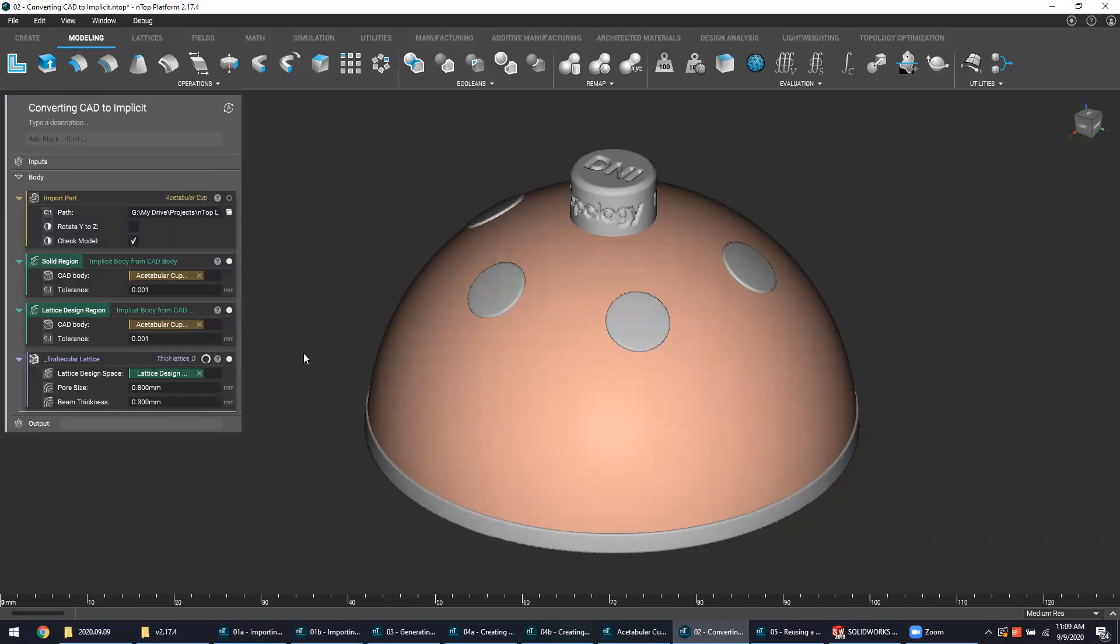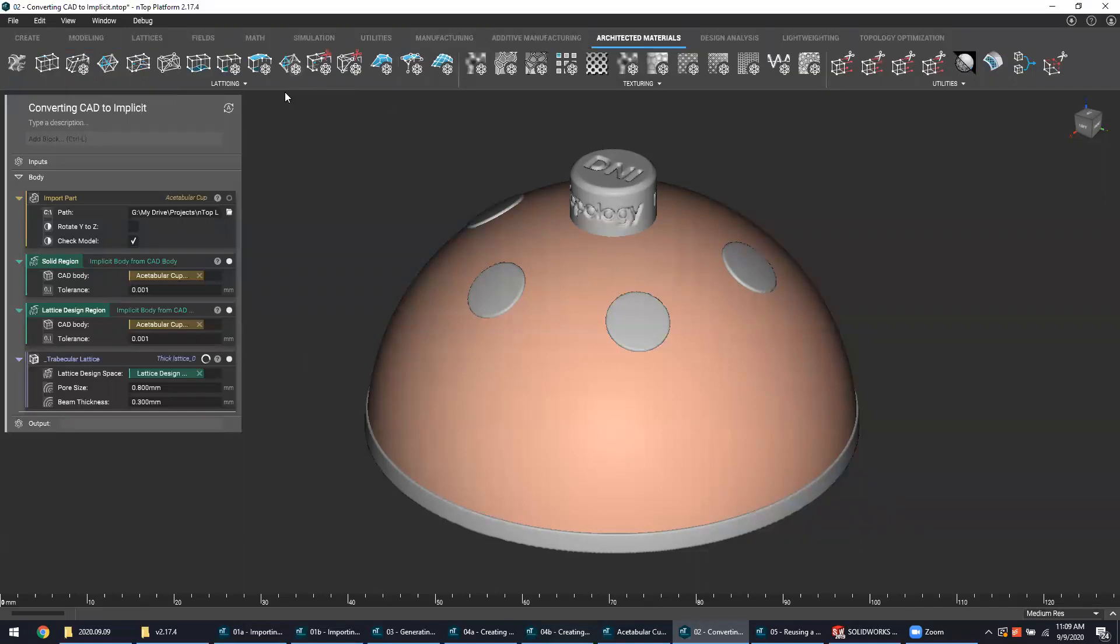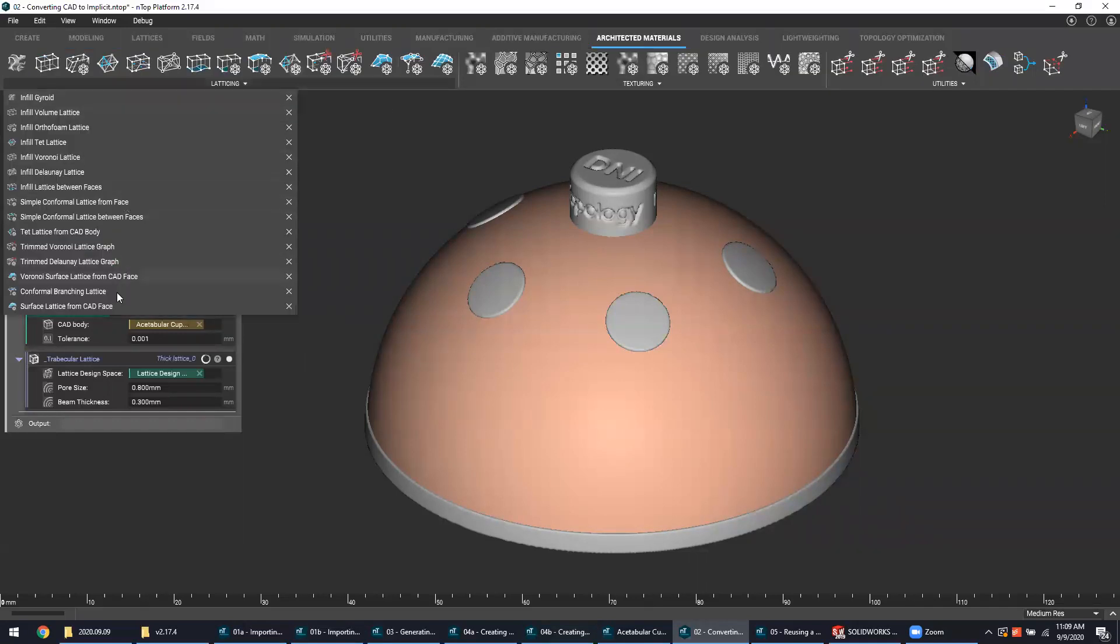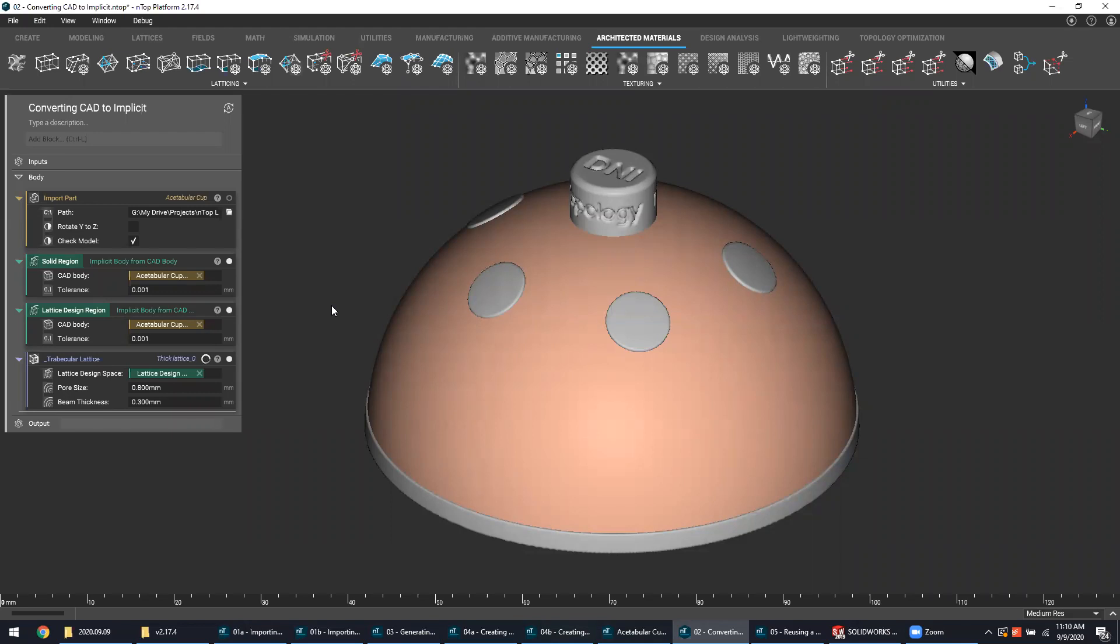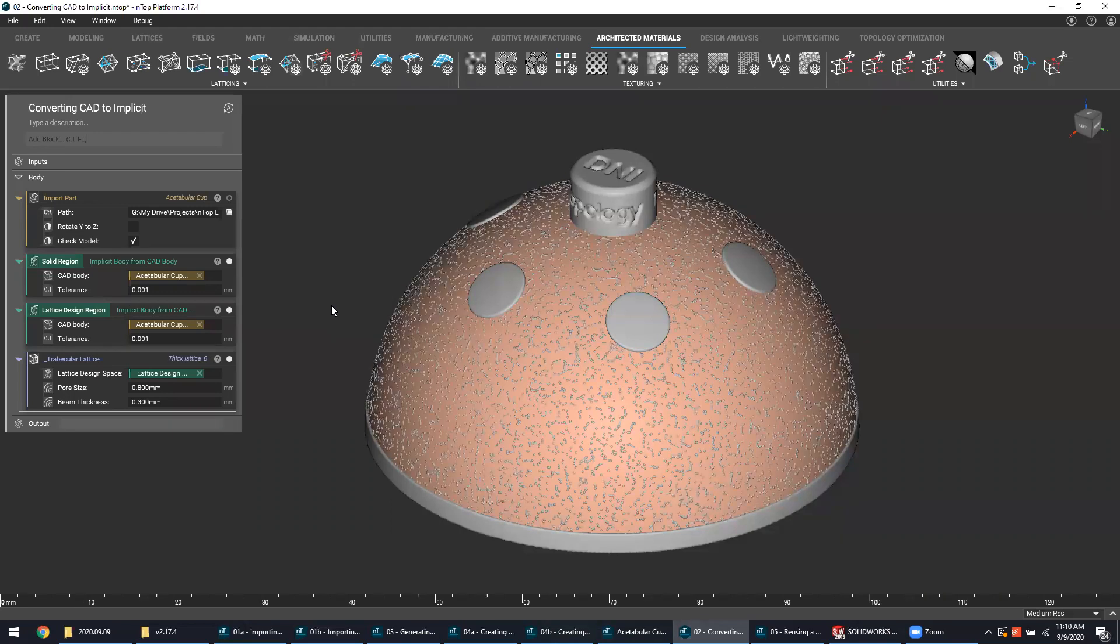Even though NTOP platform makes available different kinds of pre-made lattice generation capabilities in the form of toolkit blocks—and we can find some of those under the architected materials tab, under the latticing section of the ribbon—I have chosen to create my own custom lattice design workflow and package it up for my own usage. As a medical device designer in NTOP platform, you'll be able to do the exact same thing. You characterize your unique osseointegrative structure, you'll standardize your design process, and then ultimately you'll package up your workflow for revision control and reusability.